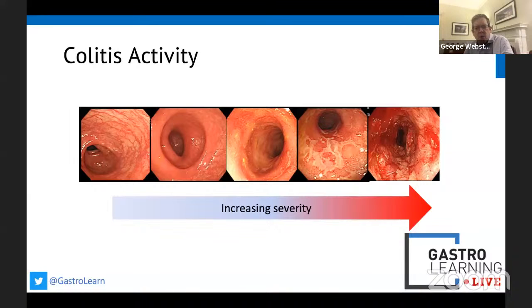Yeah, go on. Can we, we just saw a nice picture of different levels of severity. And maybe we can show that again as we discuss. When we do that initial colonoscope insertion, which of these would make you say, do you know what, I've seen enough, I'm not going to push to do a completion colonoscopy in this instance?